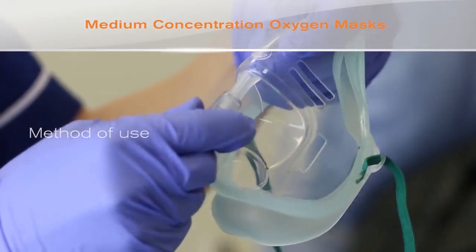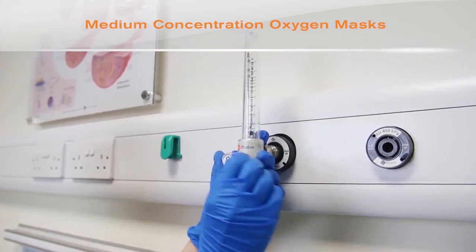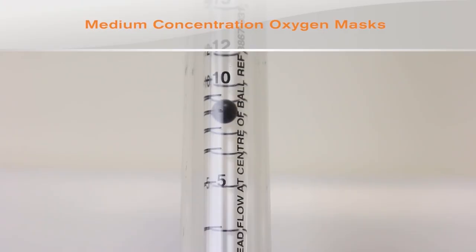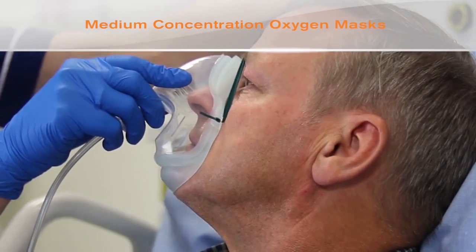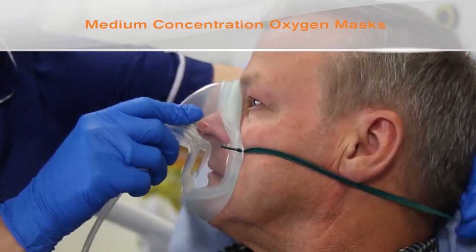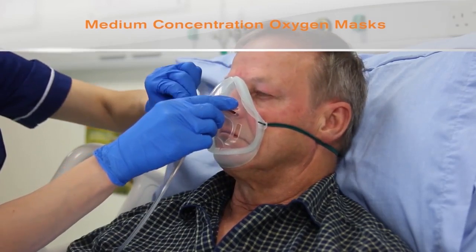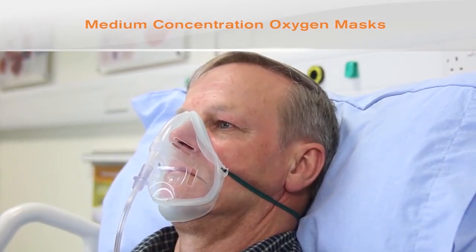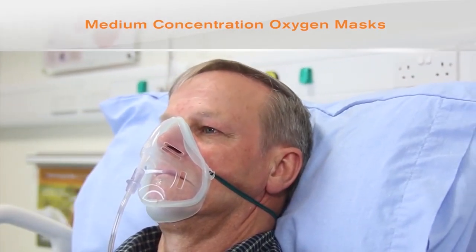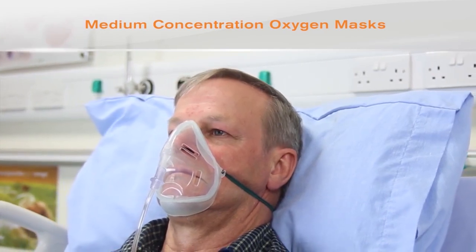One end of the oxygen tube is attached to the spigot on the mask and the other to the oxygen flow meter. The flow meter is set to give the prescribed oxygen concentration. The mask is then fitted over the patient's nose and mouth and the elastic tightened to give a secure and comfortable fit. The elastic historically has been secured over the ears. However, new generation Intersurgical Ecolite oxygen masks can also be secured under the ears to avoid the occurrence of pressure sores.